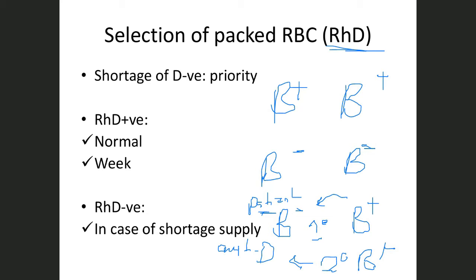Excellent, a hemolytic reaction. The anti-D will bind to the donor cell, and in the spleen it will be removed from the circulation.